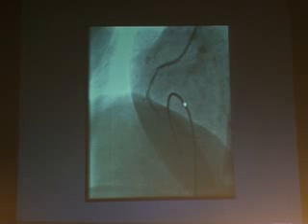What exactly did we do in this patient? We gave a lot of nitrates, intracoronary nitroglycerin, to the patient. We increased the speed of the rotablation, and then with deep throating of the guide, we tried to take it out. There was definite tug. We were fearful that it may perforate the artery, it may cause rupture, and then that's a day for you, because the patient has to go for surgery.